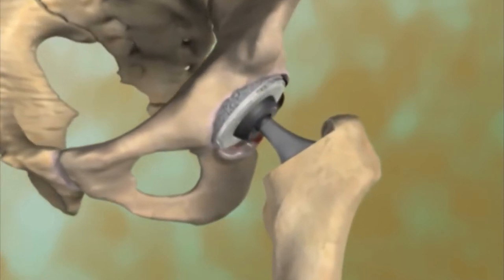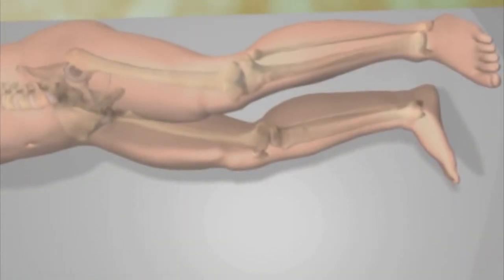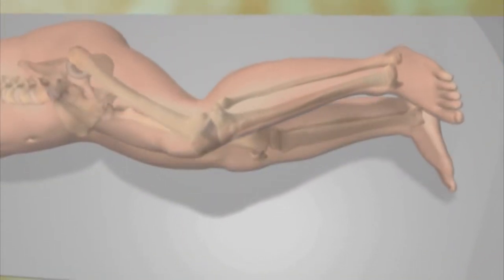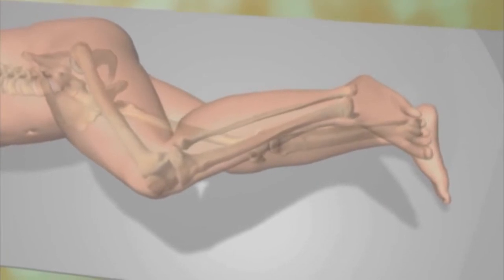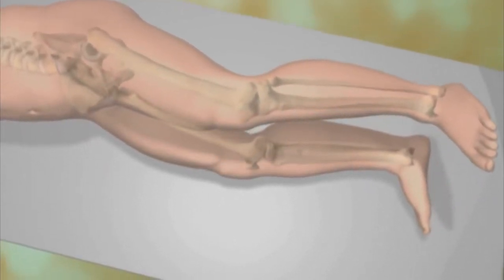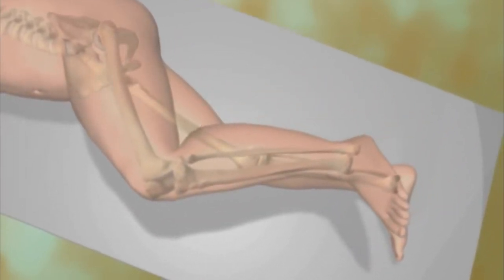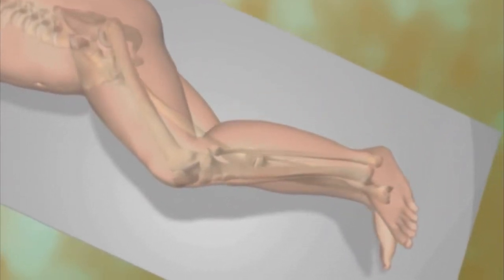Together, these components replace the natural ball and socket joint. During and after surgery, the surgeon verifies the correct fit and range of motion of the hip replacement components. By mimicking the anatomy and functioning of the natural hip joint, hip replacement can reduce pain and permit a return to many activities.